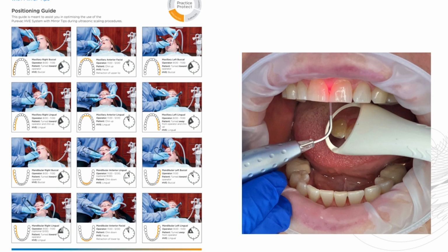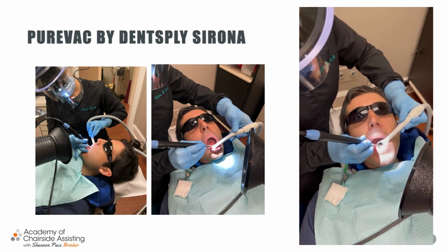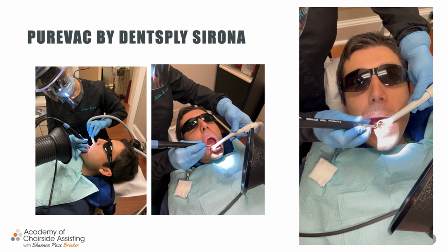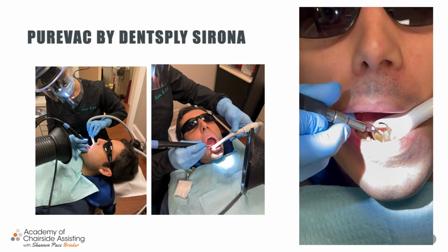Okay. Very easy to retract. And I think the easiness comes from having the rounder end that's larger. Let's show you a quick video. This is Clarissa in my practice. You can see here where she's utilizing it to retract the tongue. The hardest thing for her, again, is learning how to do that and maneuvering it. So you are going to have to train yourself, especially knowing where you're placing it.